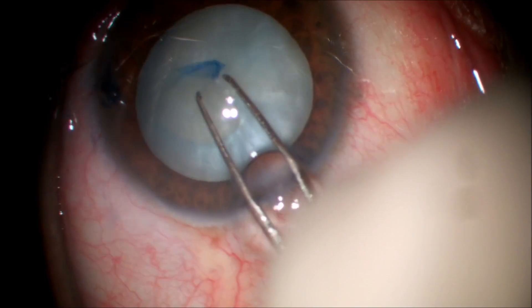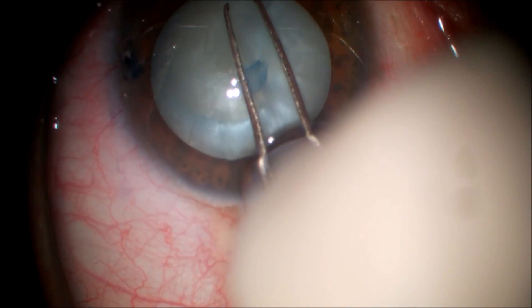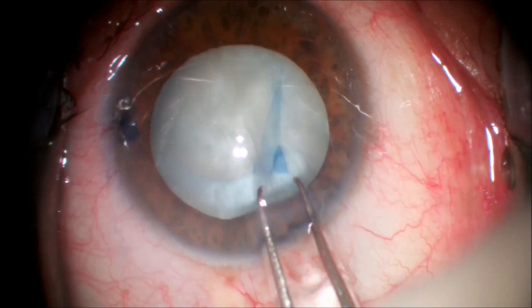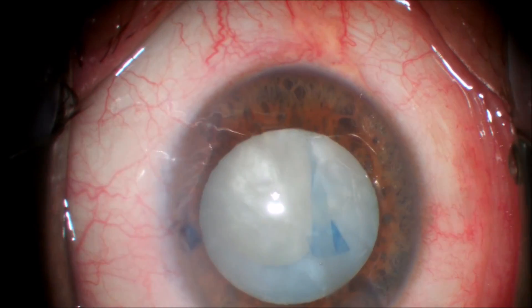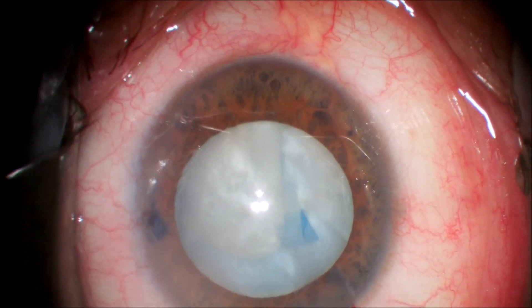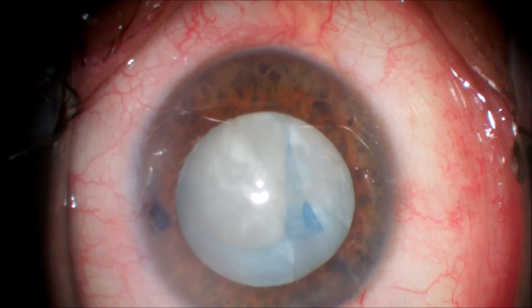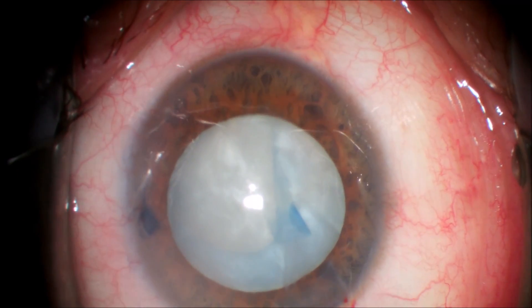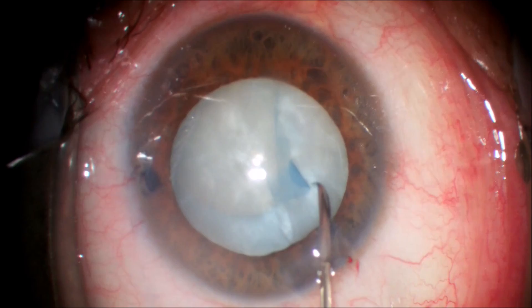You can see that we start our capsulorhexis. The capsulorhexis is being completed and we can see it's torn peripherally — this is most likely from the positive pressure inside the cataract contents pushing that capsulorhexis peripherally. At this point we can refill the anterior chamber with dispersive viscoelastic, or in this case I try to unfold and perform a Little's procedure to bring the capsulorhexis back to the center of the capsule.